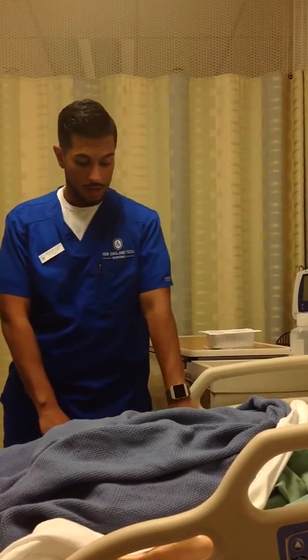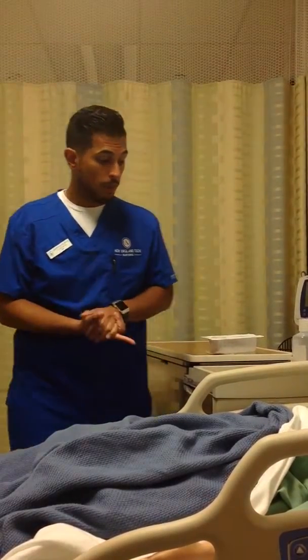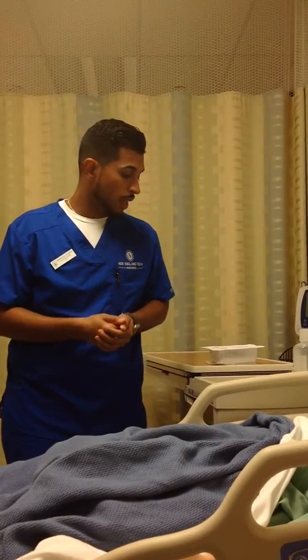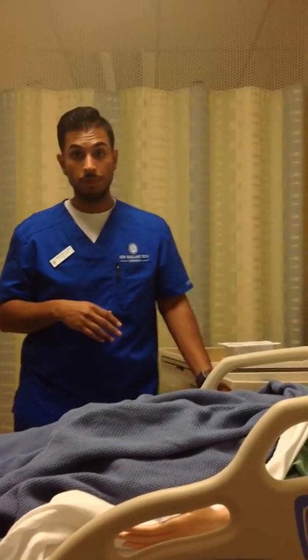After that, I would provide privacy for the patient by closing the curtain. I would then explain the procedure to the patient, that I was going to do a sterile wound change on his abdominal wound. I would then put the patient in a comfortable position. In this case, I would elevate his bed to about waist level and place the patient in supine position.